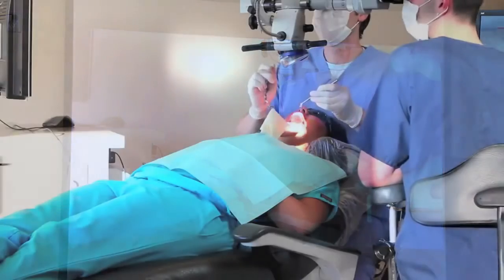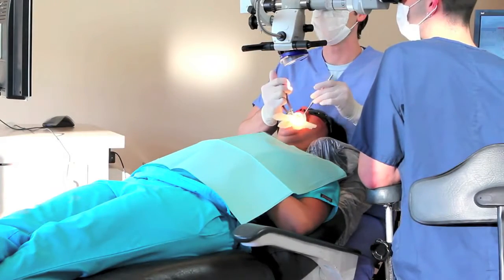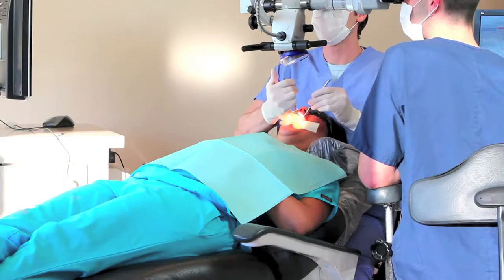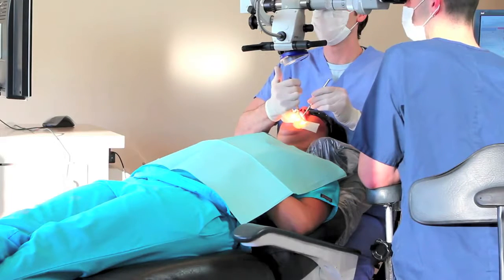So this is the placement of a rubber dam. I'm going to show you a couple little techniques that I use now because of lessons I've learned. Basically, a proper rubber dam can be placed on a tooth without anesthesia. This is my assistant. She volunteered for this. We're placing the rubber dam over a non-anesthetized tooth, and we're just working around the tooth itself.